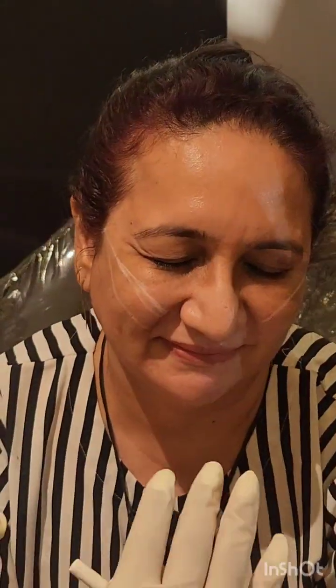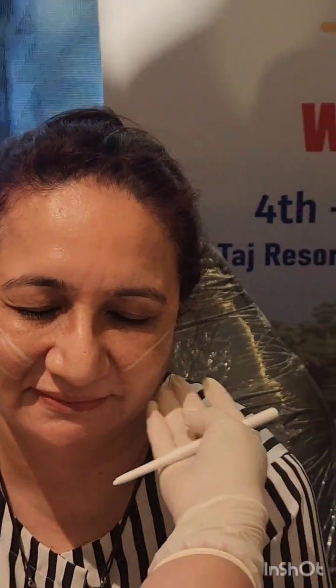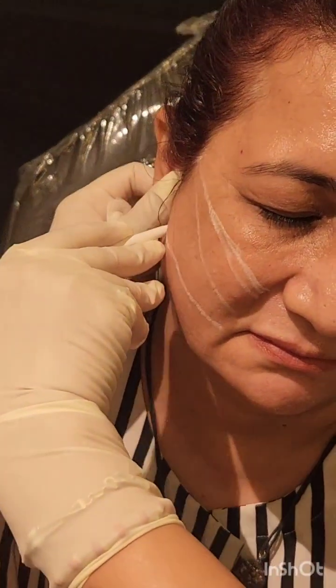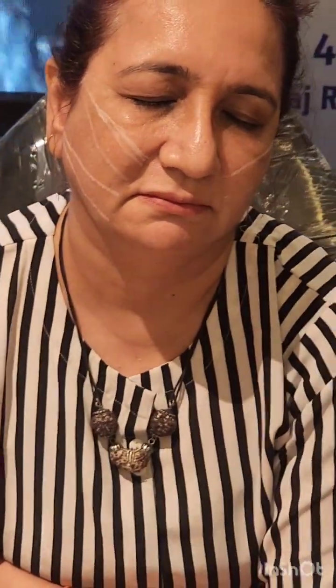I'll show you from this side also. I'll be coming from the tragus, and this is what I was telling about the box. From the jaw entry point, that will correct the marionette line, and the jawline as well.